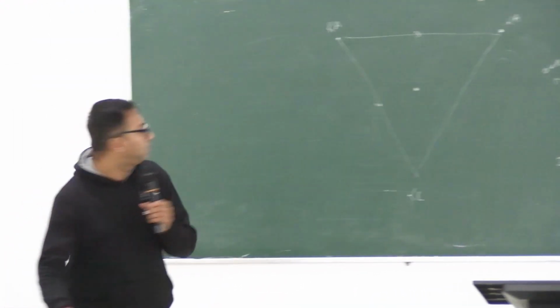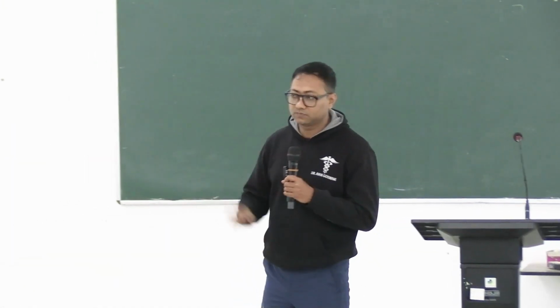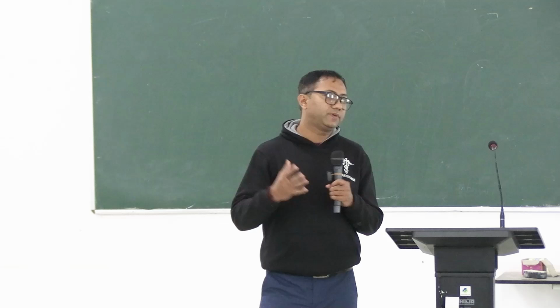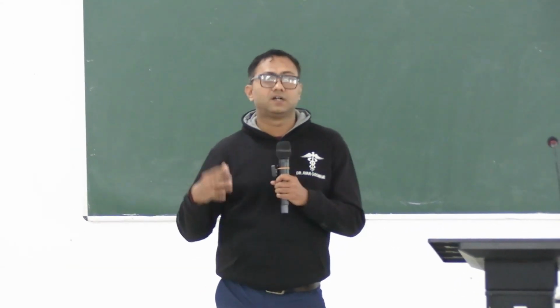Now, what is the concept of a lead? You have already known normal ECG. Now we are entering into abnormal ECG, and gradually we will discuss the physiological basis of changes in ECG for, number 1, acute coronary syndrome, number 2, heart block, and third, arrhythmia, like rhythm disturbances. So we will start with acute coronary syndrome. Commonly people call it a heart attack, but our medical terminology is acute coronary syndrome.